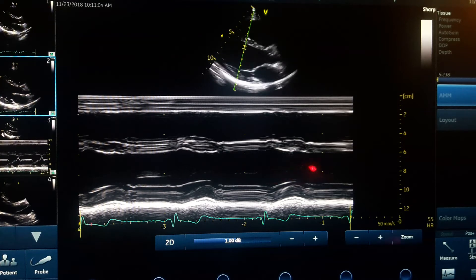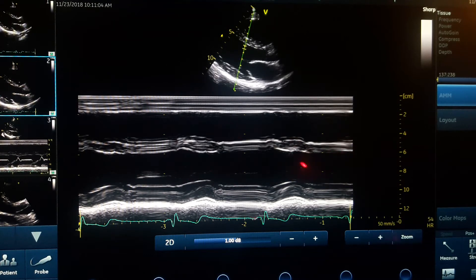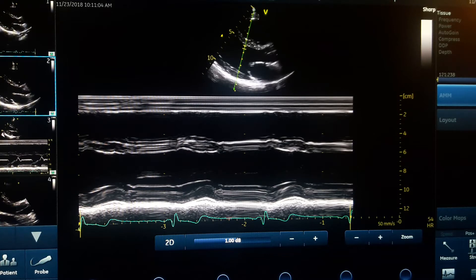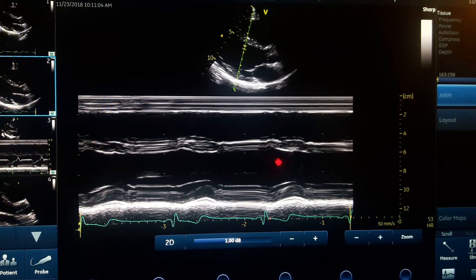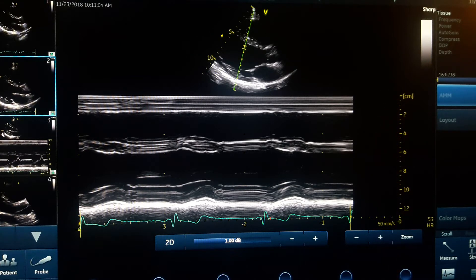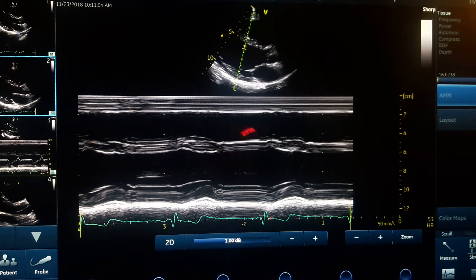You will see the M-mode diagram below the image, and it has two axes. The vertical axis represents distance — that is the reason we can measure distance, thickness of the wall, and space. The horizontal axis represents time.